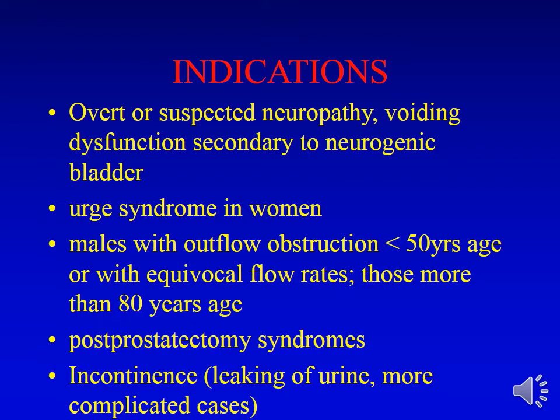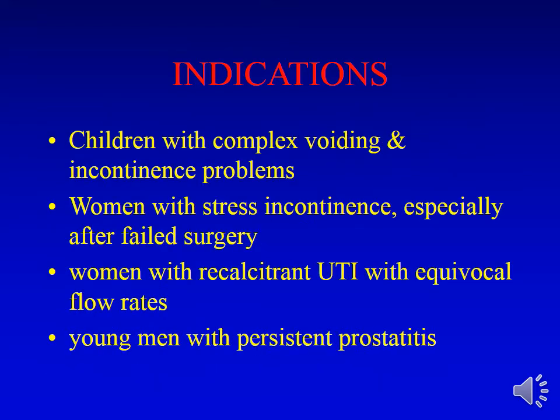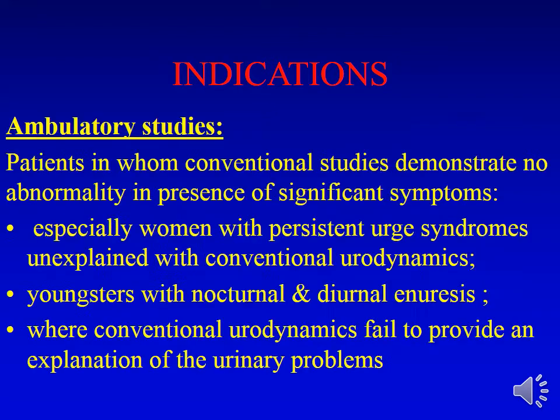Incontinence, not all incontinence. If it's a simple stress incontinence, maybe you don't need any urodynamic. But any incontinence which is leaking of urine involving more complicated cases, then we proceed with urodynamics. Children with complex voiding and incontinence problems, yes, that's an indication. Women with stress incontinence, especially after failed surgery, or some people advocate it before all surgeries. Women with recalcitrant UTI or urinary tract infection, equivocal flow rates, and young men with persistent prostatitis.